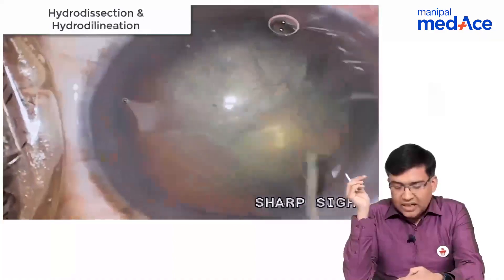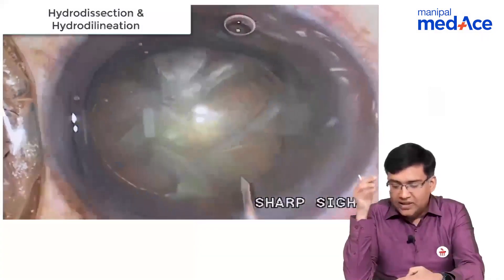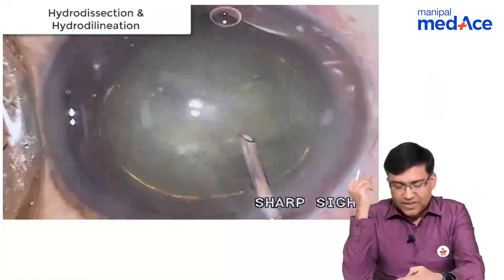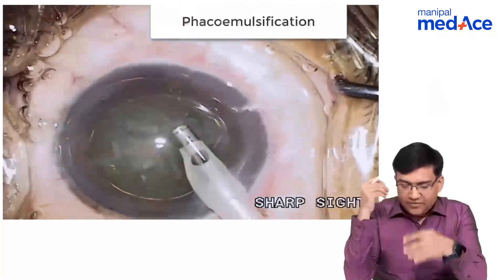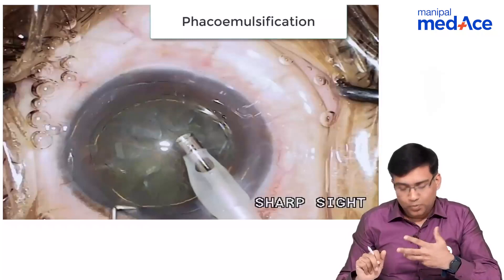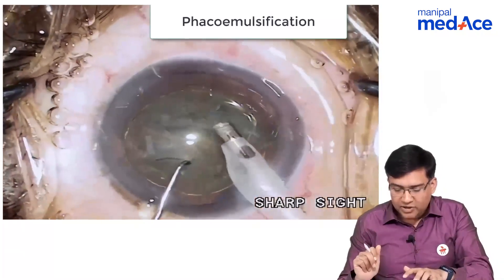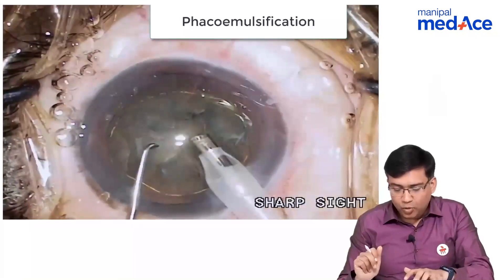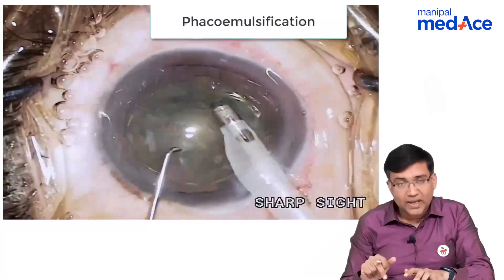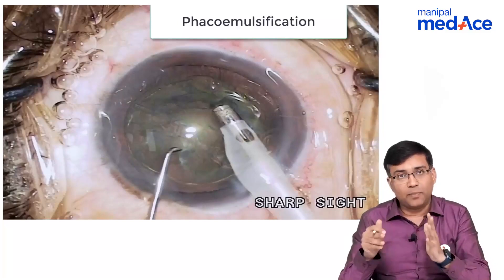We have done the hydrodelineation and now we are rotating the nucleus so that we can basically remove all the attachments. After doing this, we are doing the phacoemulsification. The phacoemulsification probe is coming through that 2.5 millimeter incision and now we are removing the epicortical material. The second instrument in our other hand is basically a chopper — meaning it chops the nucleus into various fragments.